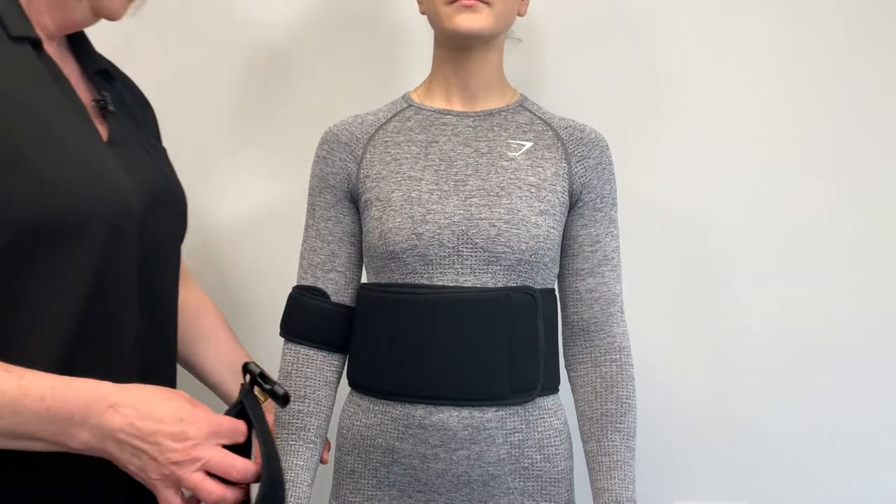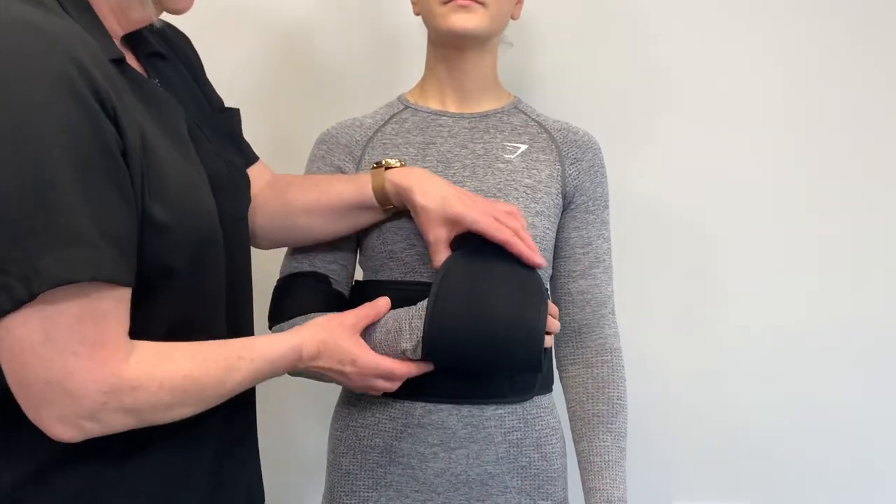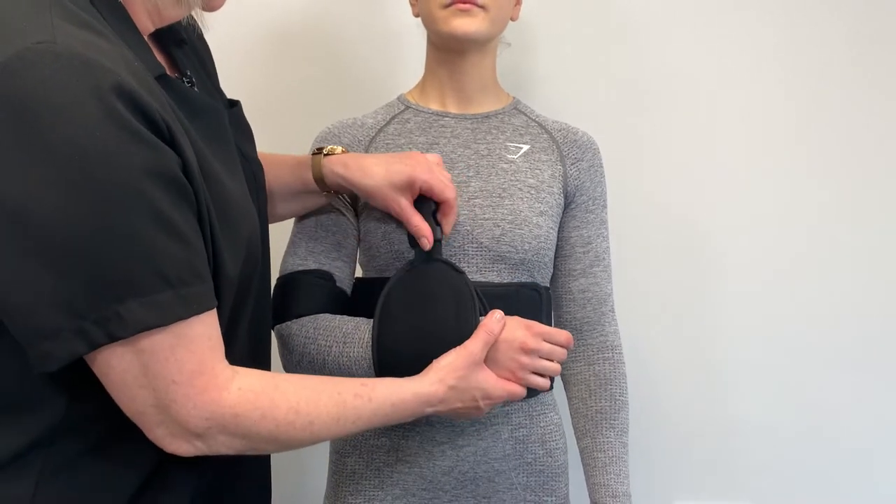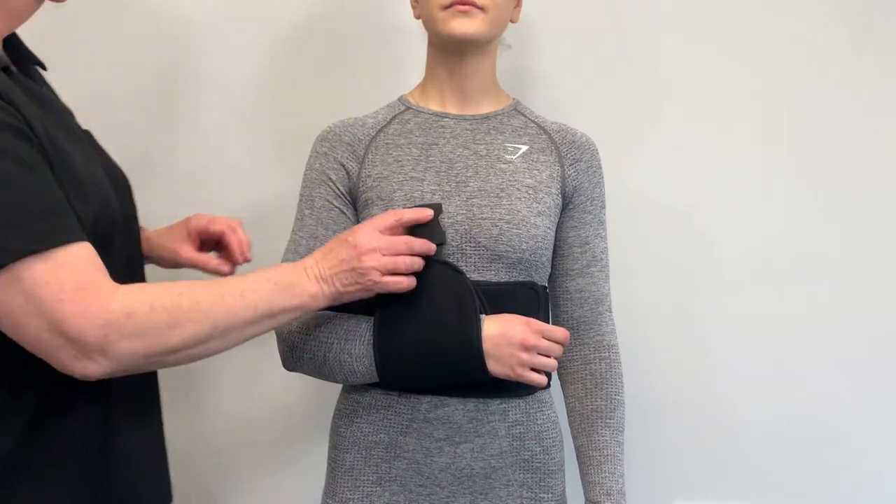Gently slide the wrist cuff onto the wrist of the affected arm, whilst ensuring the elbow and forearm are supported securely in the desired position to avoid discomfort.